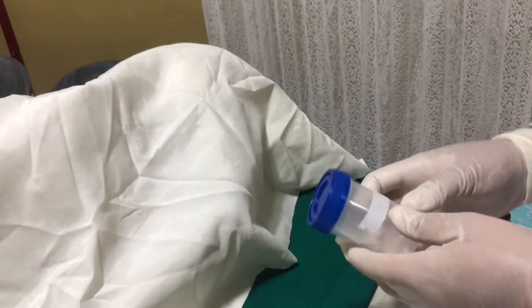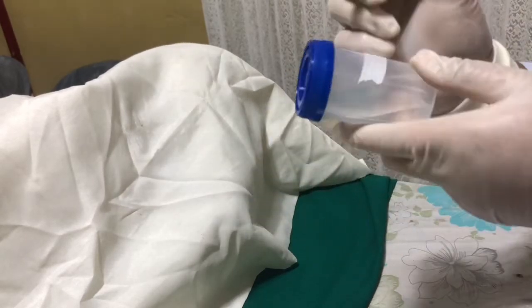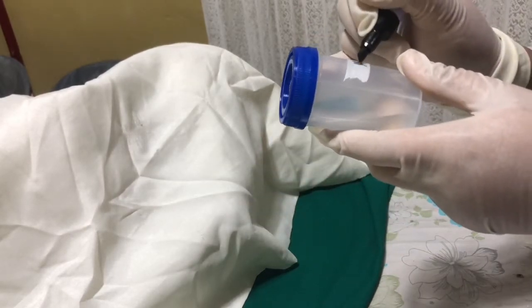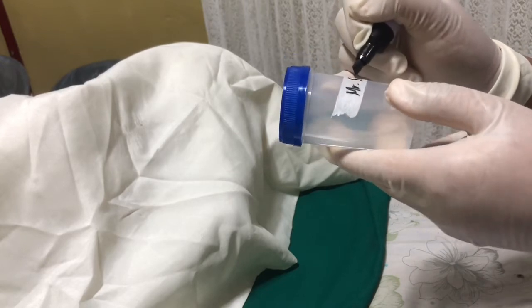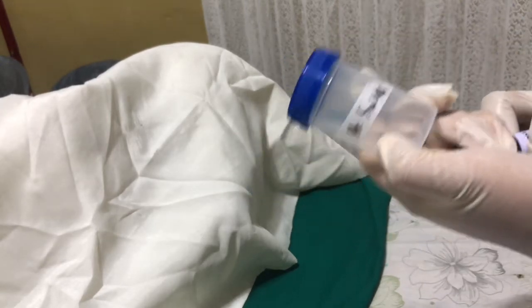Remove and clean the equipment and make the client comfortable. Label the urine specimen and send it to the laboratory promptly. Wash hands.